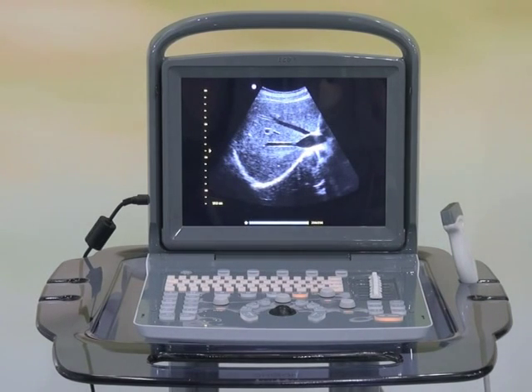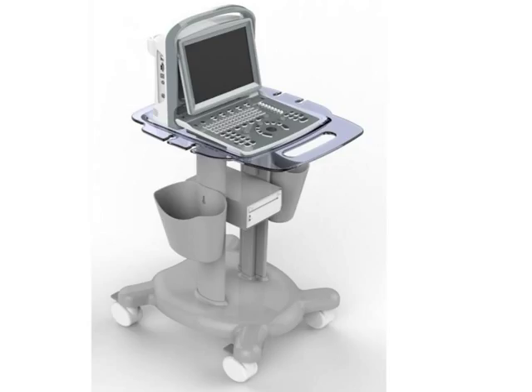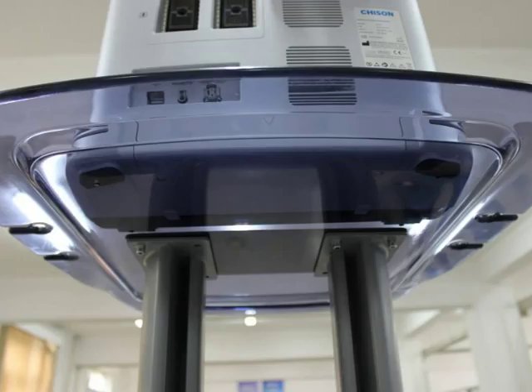It can also provide a dedicated cart solution with the TR9000. This allows you to have the freedom to carry the system in a carrying case or use it as a stationary machine on the cart.